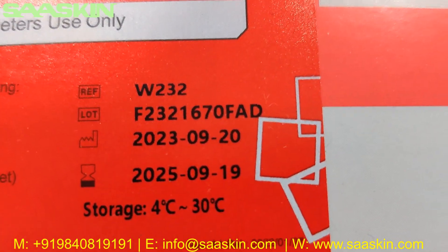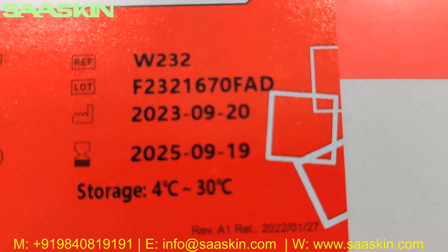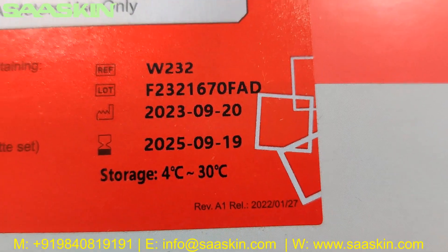It has the reference part number, lot number, and also the manufacturing date and expiry date. You also have the storage temperature range.